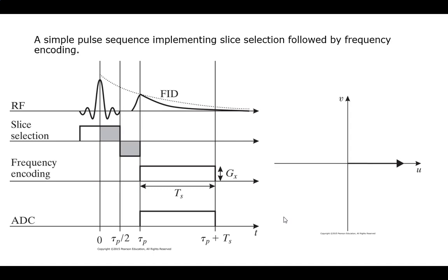Now, notice I also start at the origin. If I wanted to read the entire thing, I would have had to push it back and then write down. So I'm really just reading this portion of it. Whatever my sample time is, that's how I pick them.